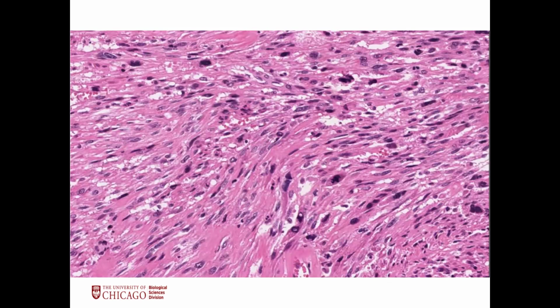But this is not always the case. Sometimes this can be kind of bland and kind of hard to find. You really have to search. In the polyps that you are biopsying from the vocal cords, in any kind of masses that have somewhat a spindle-like stroma, really look closely. Don't just quickly go, okay, next one, polyp, next one. Think about this. What can help you make the diagnosis?